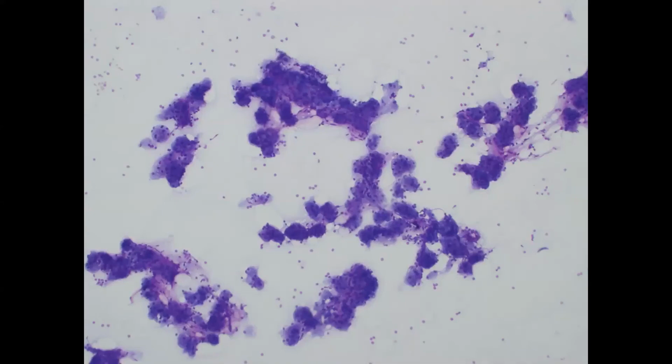You can see at low power this very characteristic grape-like arrangement. You have these nice rounded salivary gland acini that feed into these more inconspicuous ductal structures and are also tied together by blood vessels and a bit of connective tissue. But this low power bunch of grapes appearance is very characteristic, and again, it arborizes and is held together by ductal structures as well as blood vessels.